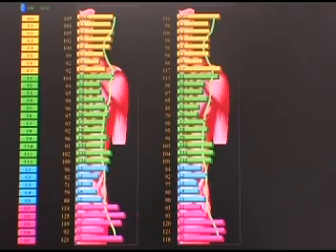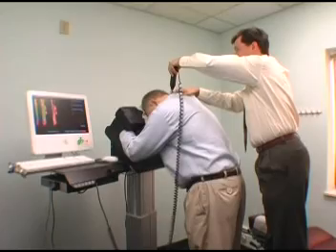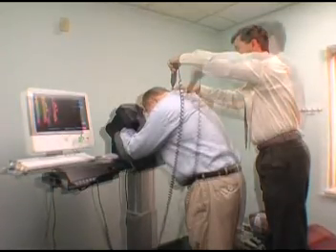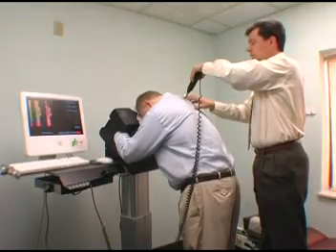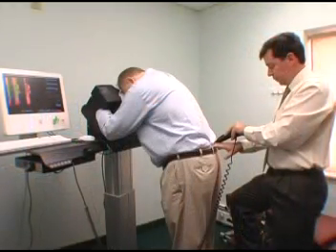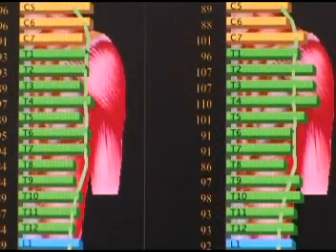And we use the information we see from that graph along with other information that we have about the patient, their case history, their examination, their x-ray findings and so on, to determine where we're going to actually adjust the patient. And then the adjustment is given, and the third graph is the one that shows the changes that were made in the spine after the adjustment. And that's where we're looking to find corrections from the stiff areas of the spine.